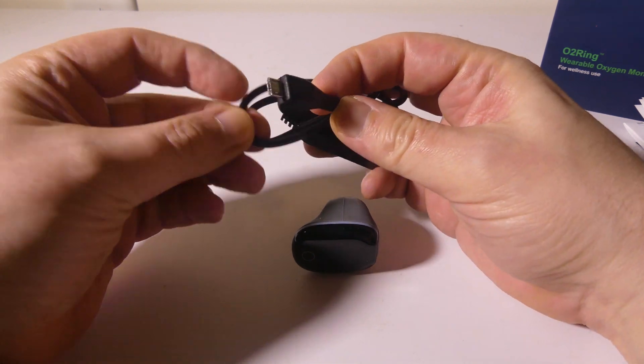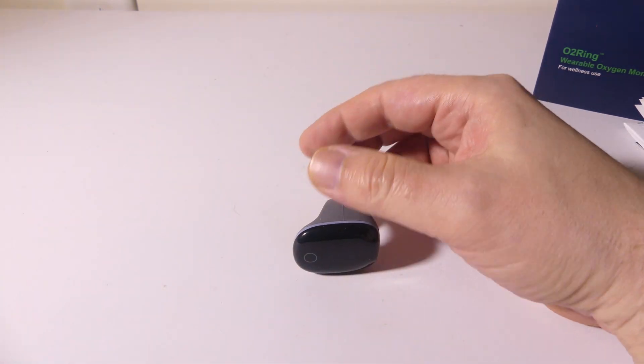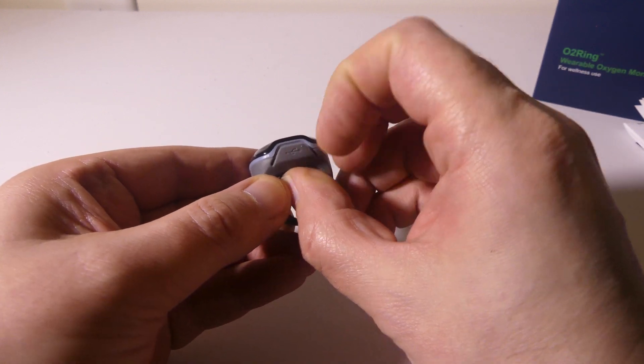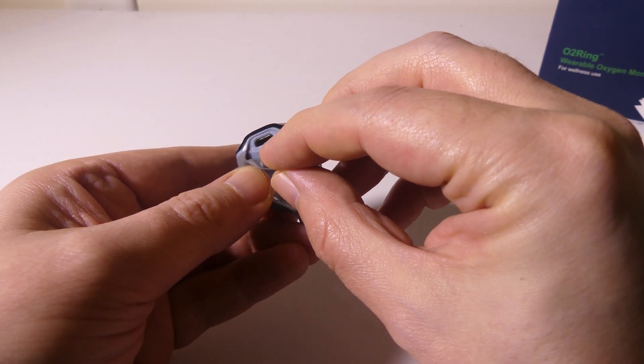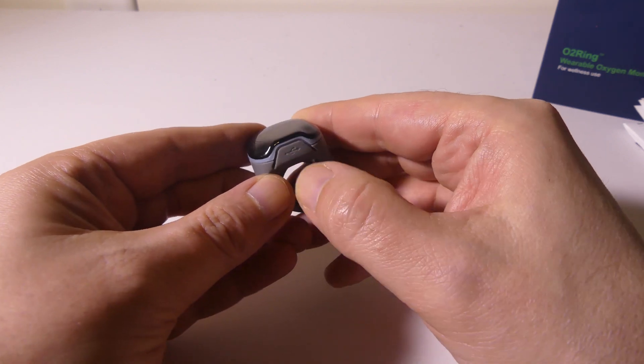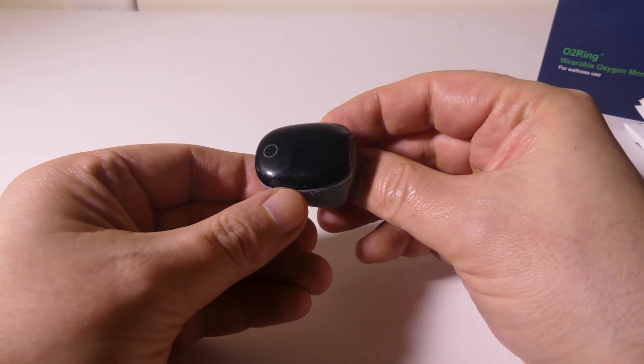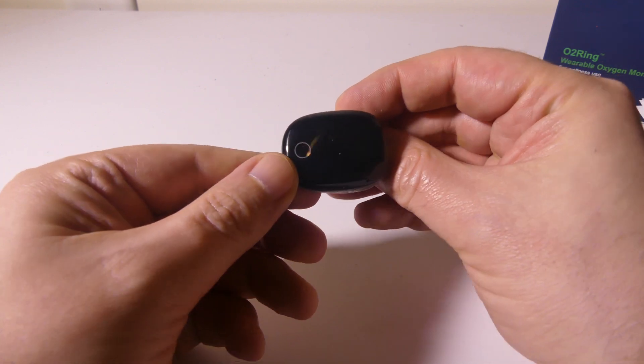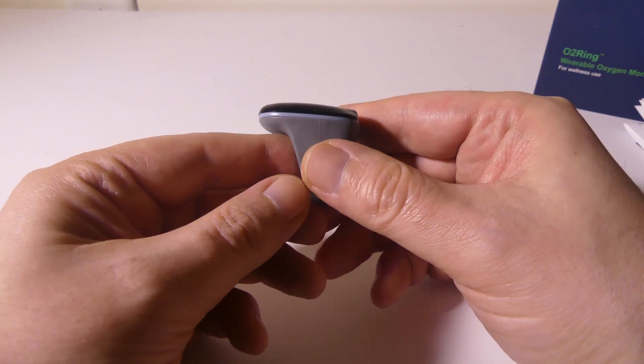It charges via micro USB — you get a USB to micro USB cable, and you can plug it into any PC USB port. Underneath a small flap is your micro USB port for the device. It's also IP24 rated for dust and water resistance, just in case you wanted to know.